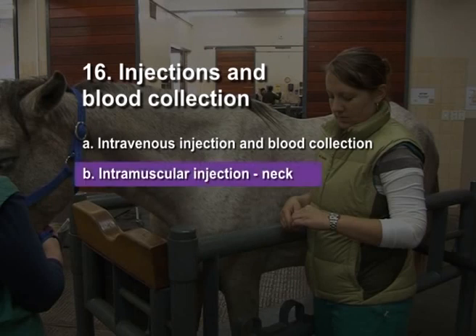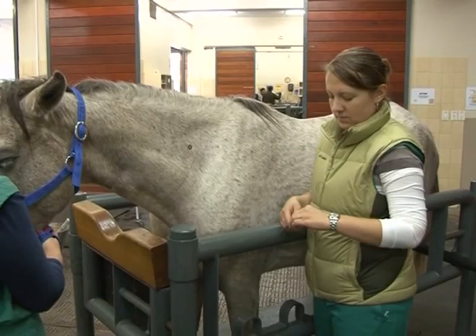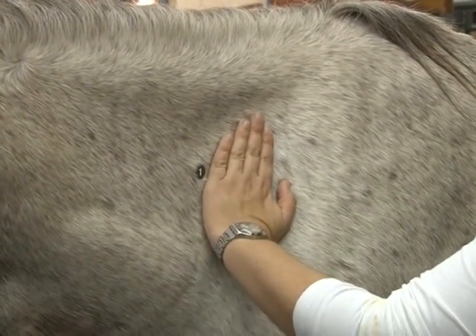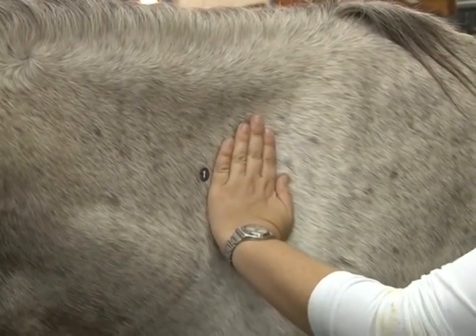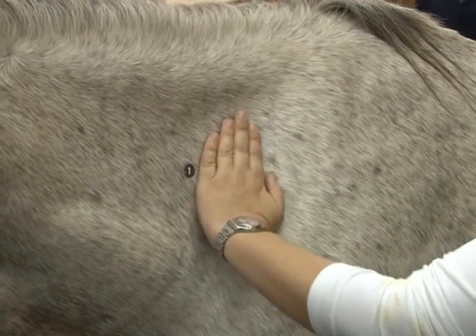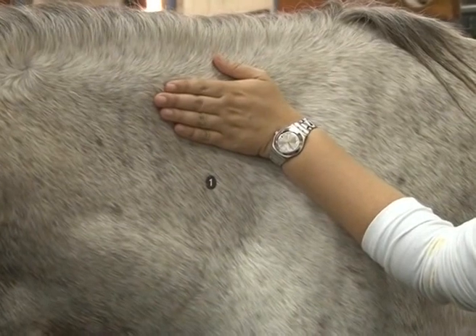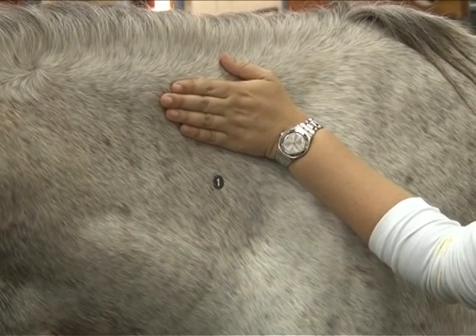Intramuscular injection — neck. Restrain the horse properly. In an adult horse, the area of choice is in the neck. Locate the injection site a hand's breadth in front of the shoulder or scapula, above the spinal column and below the ligamentum nuchae. If the skin at the injection site is grossly contaminated, it should be cleaned prior to injection.